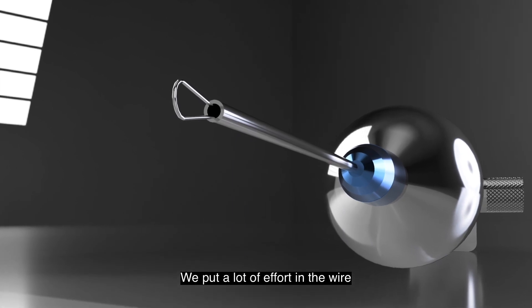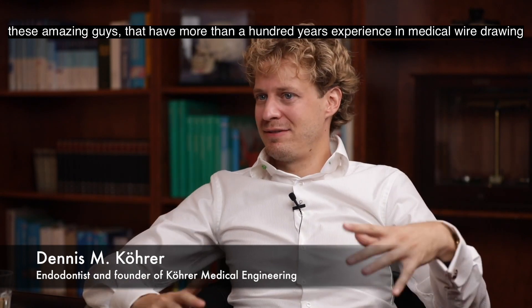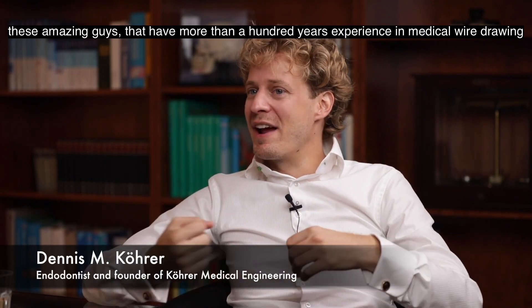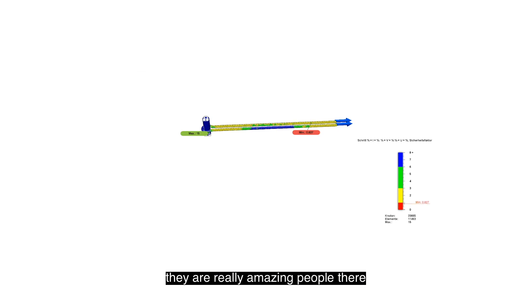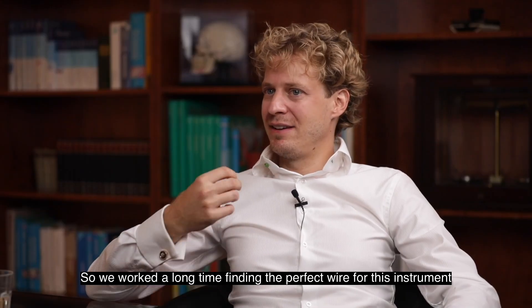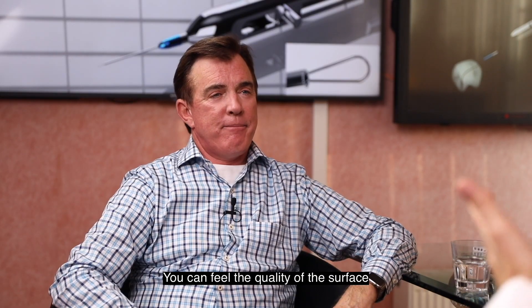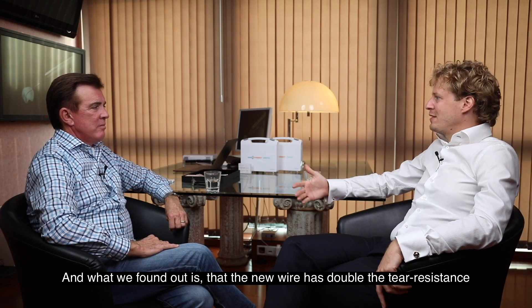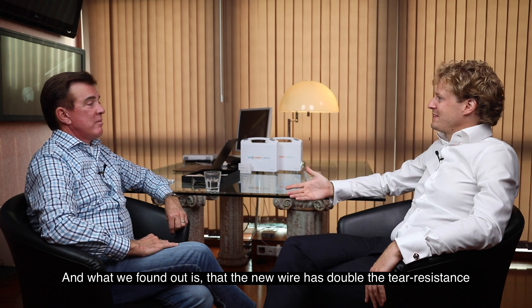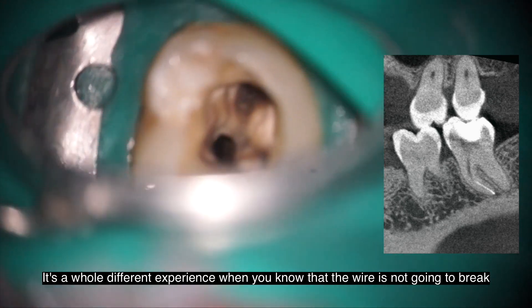We put a lot of effort into the wire. We have a partner — amazing people who have more than a hundred years of experience in medical wire drawing. They did a fantastic job. We worked a long time finding the perfect wire for this instrument. You can feel the quality of the surface, and what we found is that the new wire has almost double the tear resistance of traditional stainless steel. It's a whole different experience when you know the wire is not going to break.